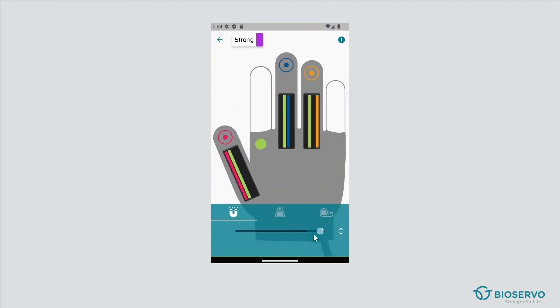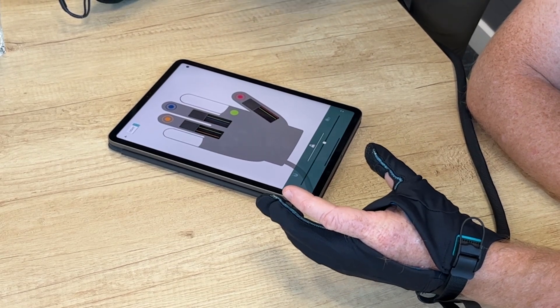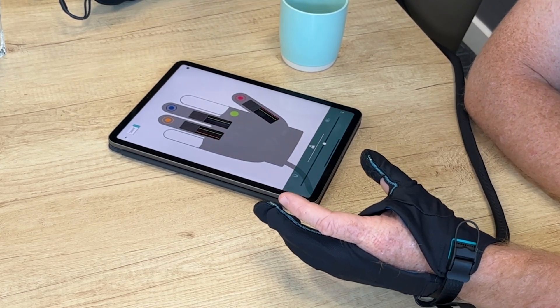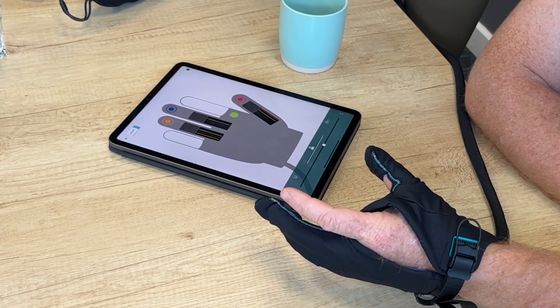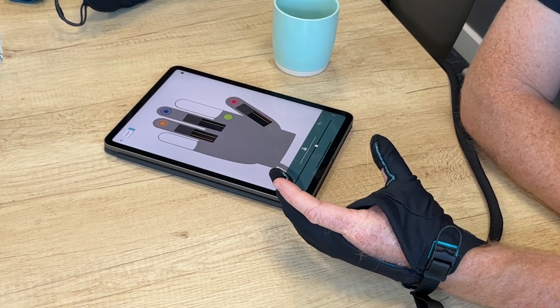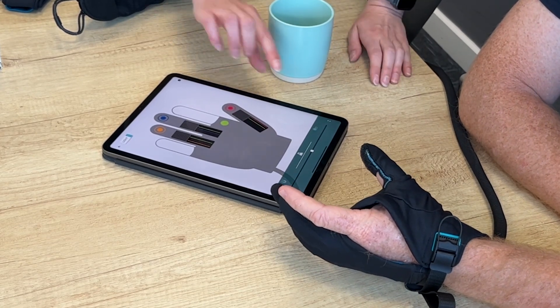The second setting is force — the amount of grip strength placed on the object. If you intentionally squeeze a little more, it will amplify that further, always working in line with your own intention. When asked about maximum force, Carolyn confirmed it will not snap shut on your hand — there are industrial versions, but even those won't do that. There is definitely a safety feature built in.